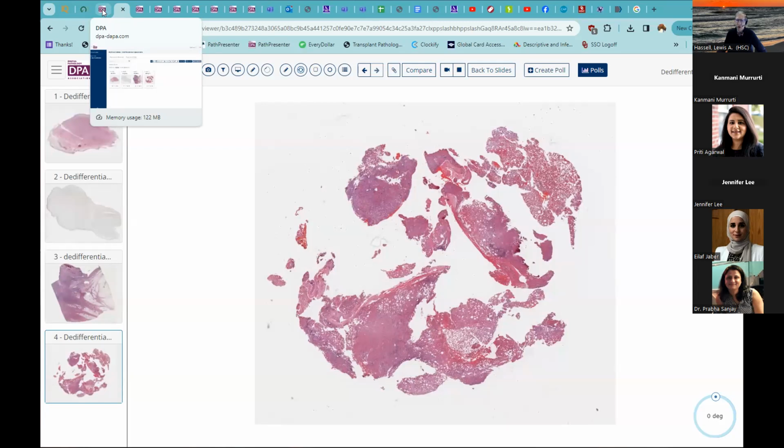And so surgical control of these well-differentiated liposarcomas is primarily directed towards removal of the dedifferentiated regions, the high-grade areas, with the recognition that you're inevitably going to leave behind some low-grade or well-differentiated liposarcoma.